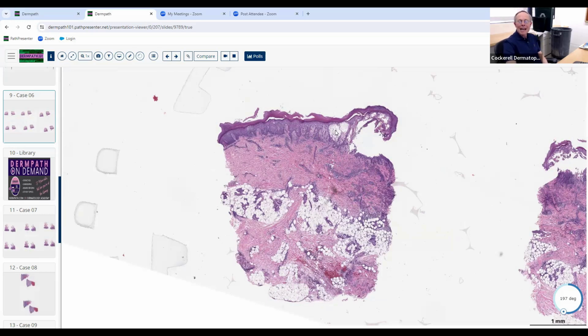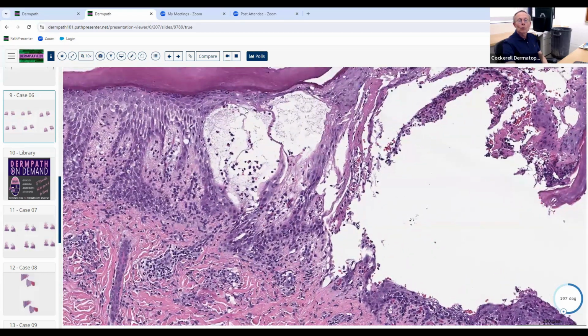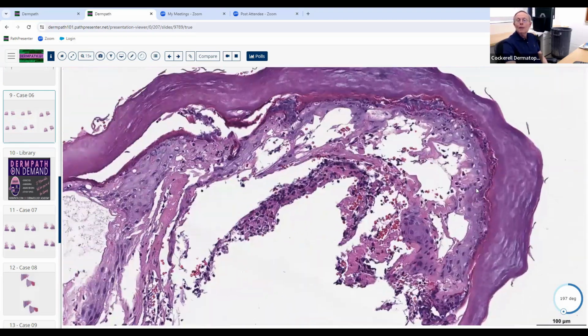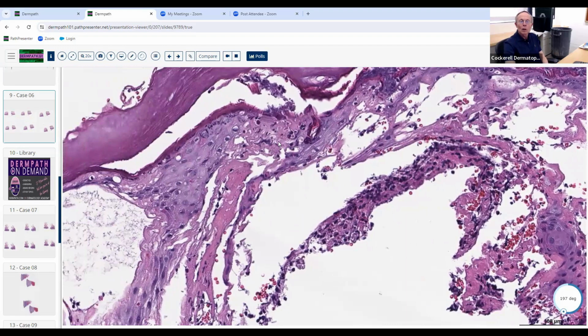And then once again, we've got some pallor within the epidermis and possibly even in the papillary dermis here, like we just had before. You've got the reticular alteration again here. See that? Strands of some of these epithelial cells and the little papillary dermal strands of collagen trying to pull it back up. So once again, you've got some ballooning degeneration. Now, this time you don't have any intranuclear inclusions. You've got all sorts of necrotic keratinocytes here that are ballooned, but you don't have the little round discrete inclusions. This whole epidermis here is degenerating. Notice that that's different. No inclusions.